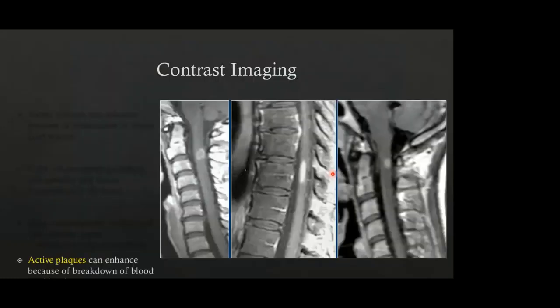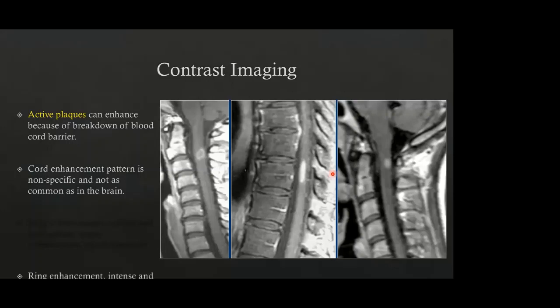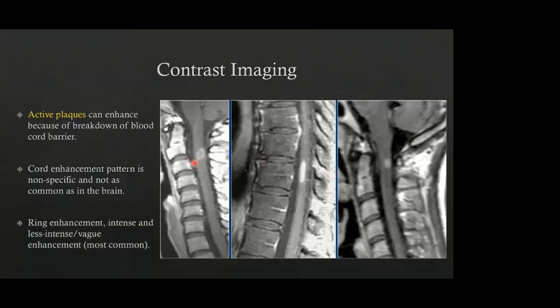On contrast imaging, active plaques can enhance due to breakdown of the blood-cord barrier. The cord enhancement pattern is not very specific and is less common than in the brain. Three enhancement patterns can be seen: ring enhancement, intense enhancement in a cigar-shaped lesion, and vague or less intense enhancement, which is the most commonly observed.